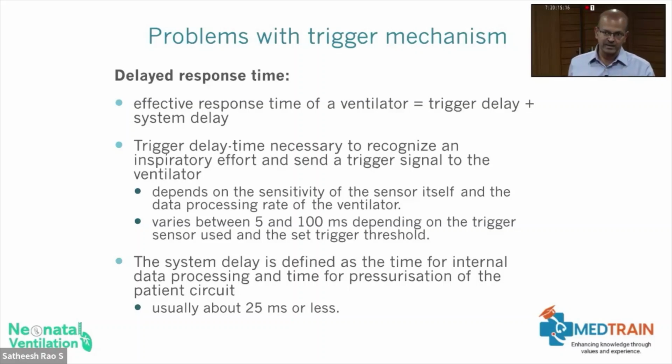If you buy a cheaper ventilator, you need to look at these aspects. You may be saving on cost, but what is on the tin may not be reflected. It may say it will do volume guarantee, but the synchronization won't work. The measurement lag is more. That's why most of us prefer a reliable ventilator. This cheaper ventilator may show the same function.